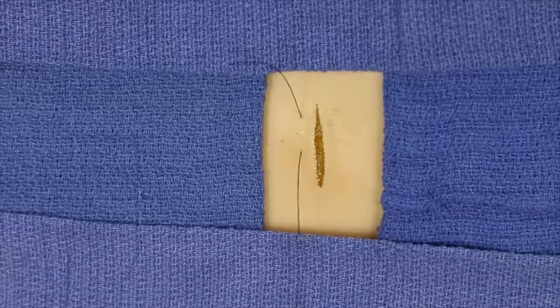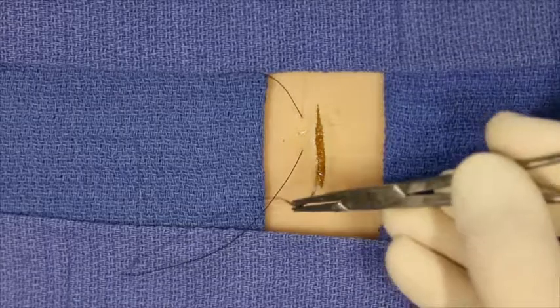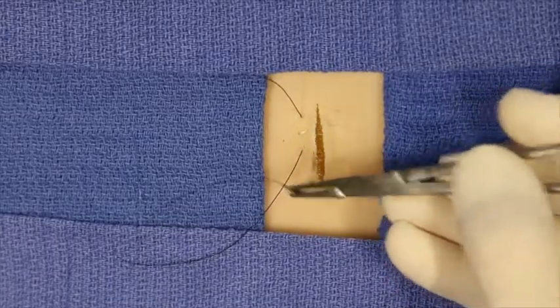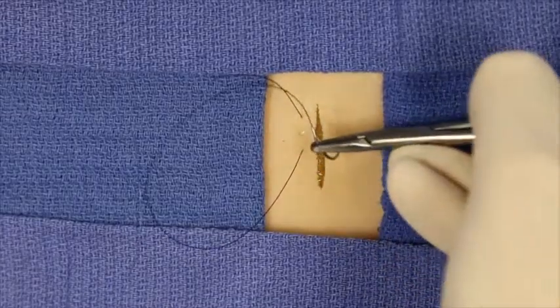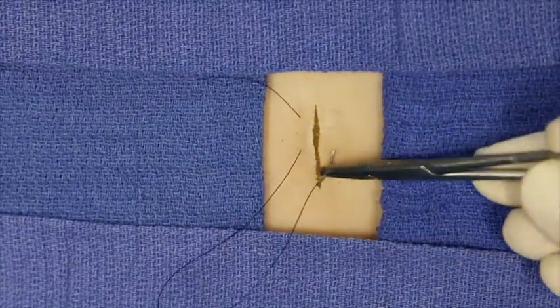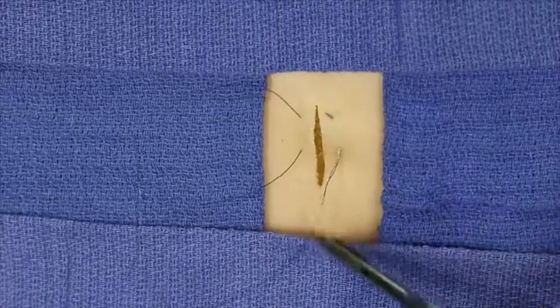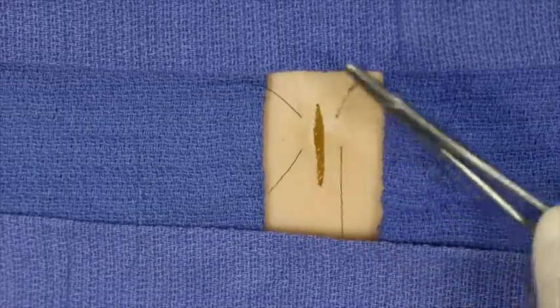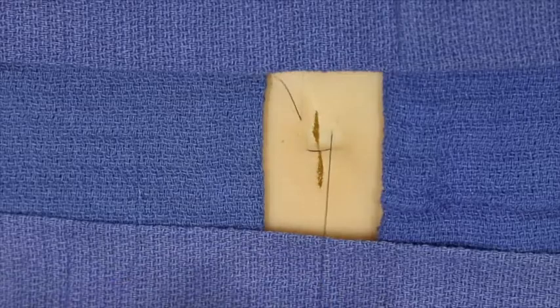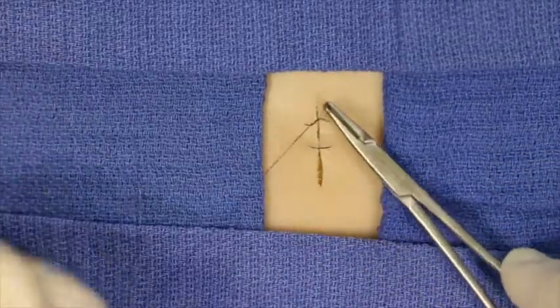The needle is reloaded and then on the contralateral side of the wound edge, equidistant from the wound edge, the needle is again inserted at 90 degrees and exits directly across from its entry point. At this point suture material is pulled through and a knot is tied.